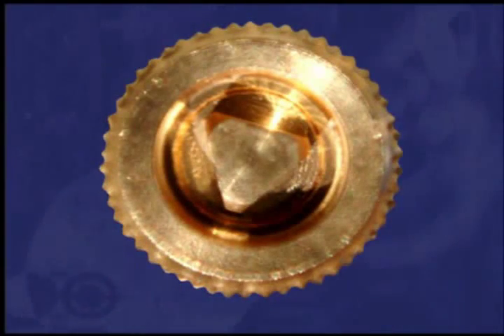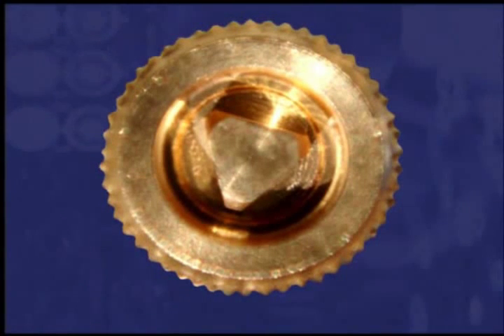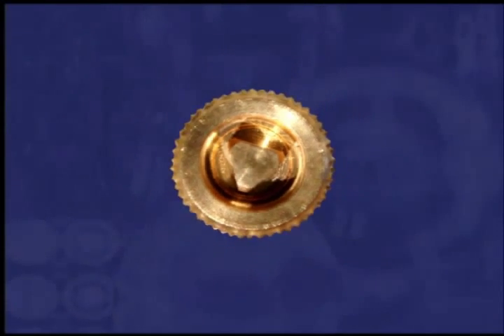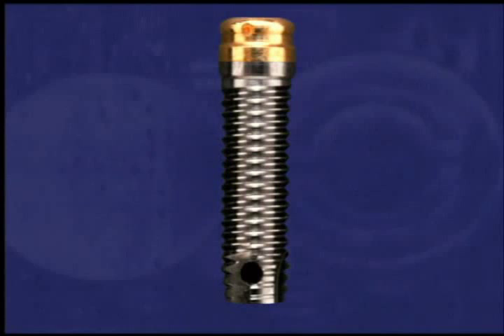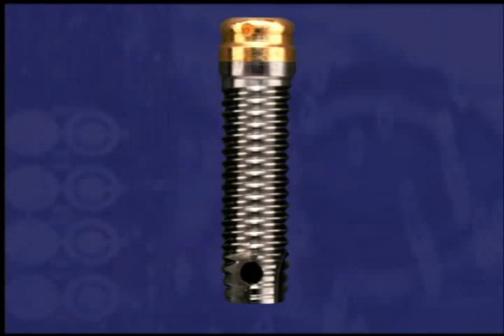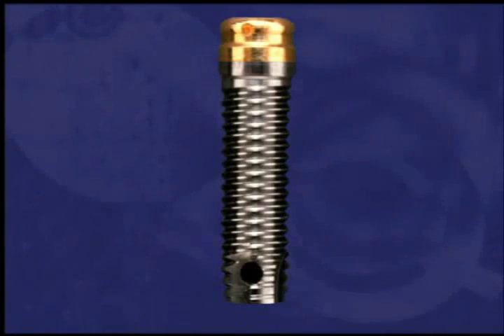A special locator abutment driver is used to place the female abutment. It can withstand torque well above the 20 Newton centimeters of force recommended to seat the abutment. Locator abutments are available in tissue cuff heights ranging from 1 millimeter to 4 millimeters. When the locator abutment is fully seated, there are no undercuts to present a problem during acrylic resin pickup of the male component.